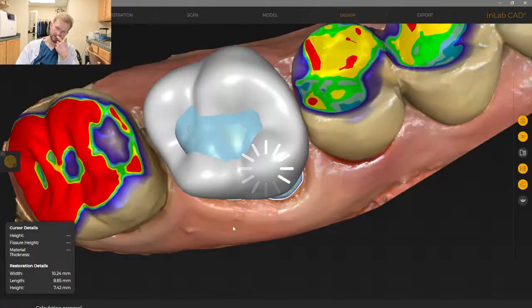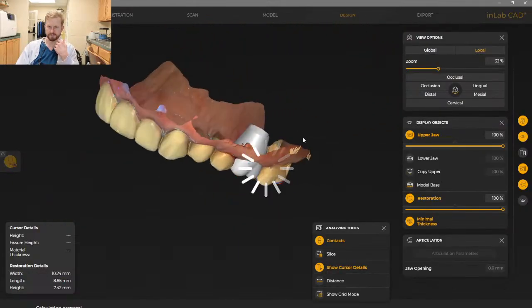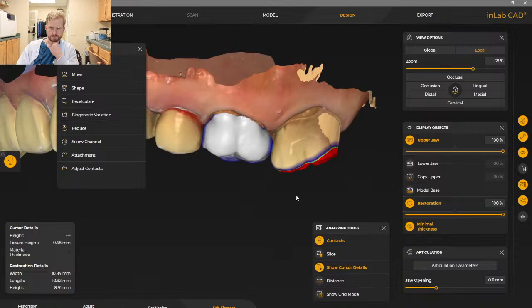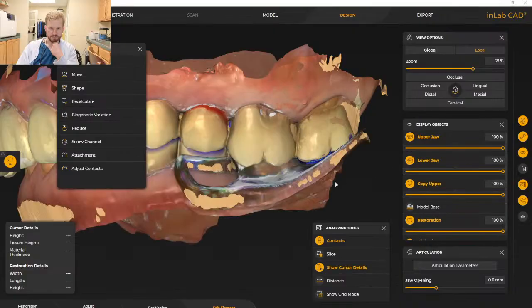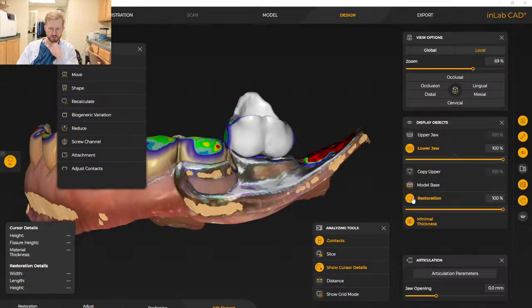We go straight into edit element to generate our proposal, and this is where we're really going to see the super eruption of that 14 and 15 position of molar teeth here. Look at our pre-op to start. Teeth are way down here in no man's land, but if we put the opposing on, you will see she's got this cast metal partial.